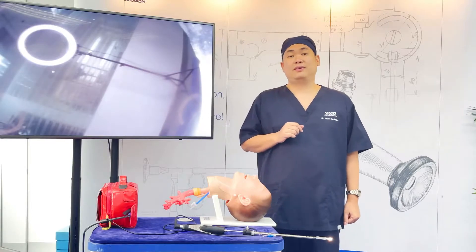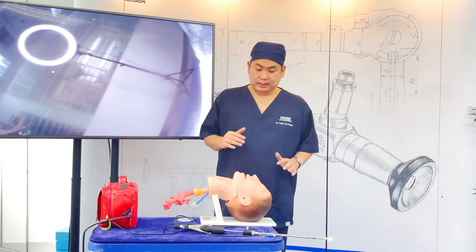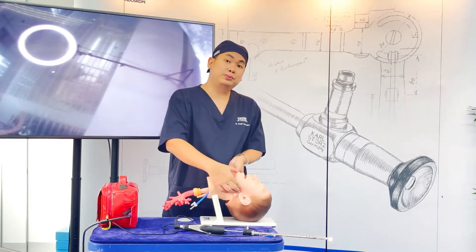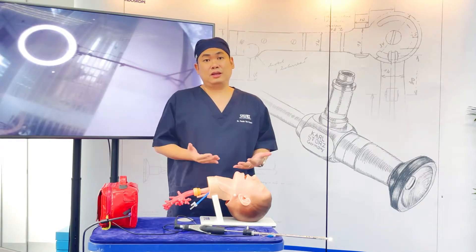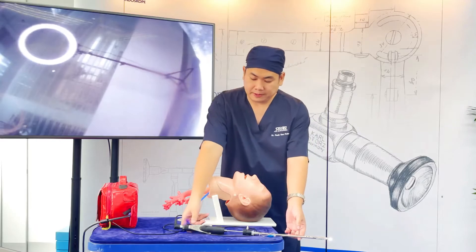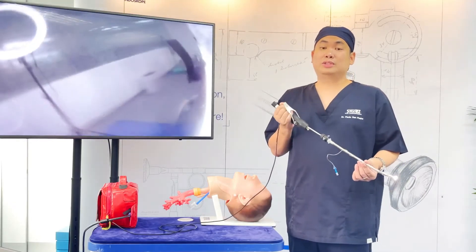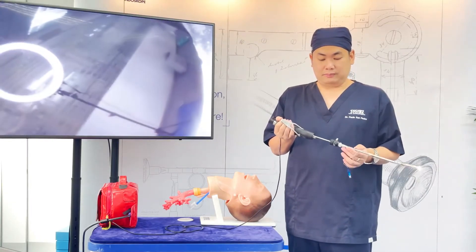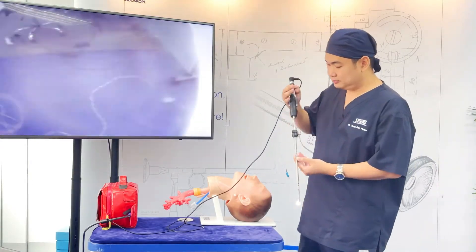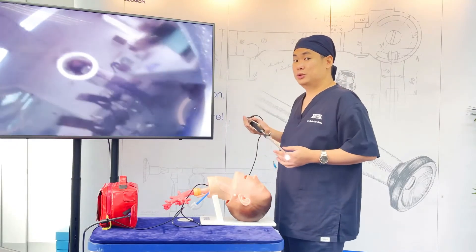An easy way of using the CMAP-DS is the midline approach. To do this, you need to perform a jaw thrust. The easiest way is to ask someone to do the jaw thrust for you. This is particularly important so that you can concentrate on the intubation itself. Hold the CMAP-DS with your dominant hand — though you could use either hand, in the beginning it's easier to use your dominant hand. Since this is a mannequin, it's like someone is doing the jaw thrust for me.